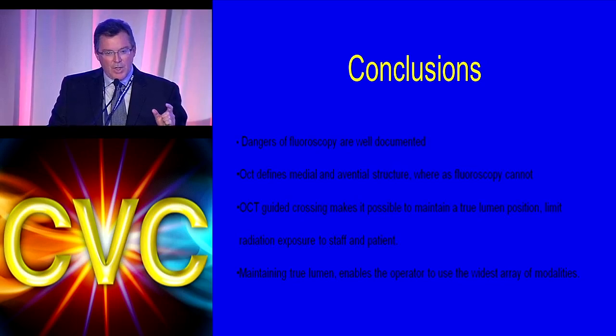All right. OCT-guided crossing makes it possible to maintain a true lumen position and limit radiation exposure, I think both to staff and the patient, and, as I said, staff including the physicians. And maintaining true lumen enables the operator to use the widest array of modalities that you want to use, and I think much more successfully and quicker. I think that's where you can even reduce your therapeutic time. If you're really truly within the true lumen, you haven't extended the vessel from tears or perivascular hematomas as we see on ultrasounds. So I think you can be much more successful with treating these patients, the lesions as well. Thank you.